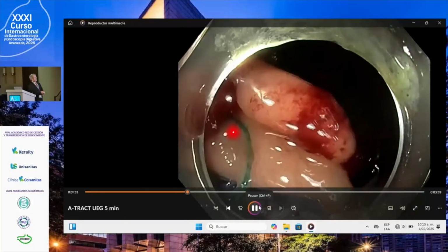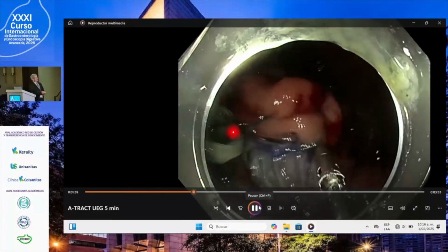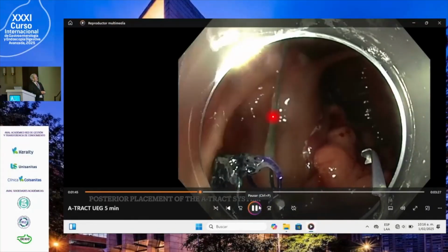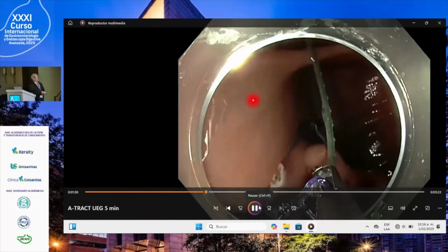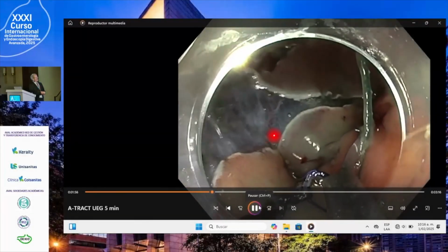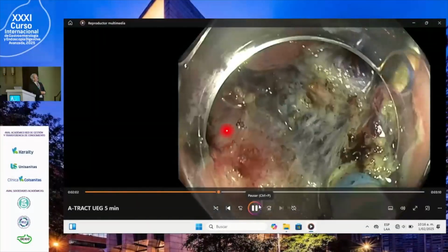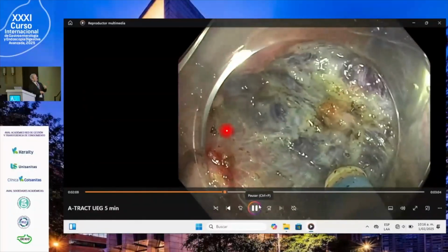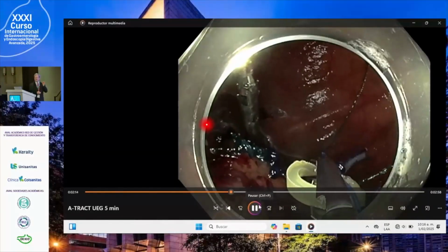And then this is a little complex, I must say. We insert a first clip with a thread, okay? A thread here, you see? The system is a little complex on the left, but you will understand. We take another thread and use another clip on the opposite side. Of course, we put the clip exactly at the edge of the lesion. Then we attach the rubber band to the opposite wall, and we continue. We better see, thanks to the traction. Traction is mandatory.